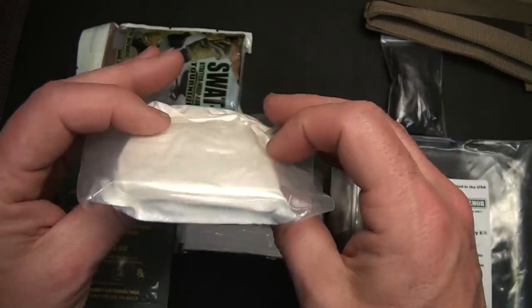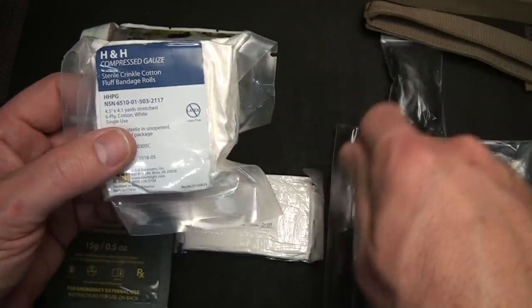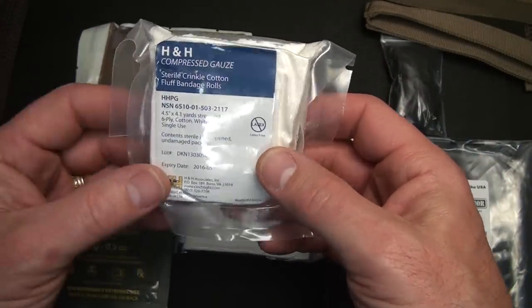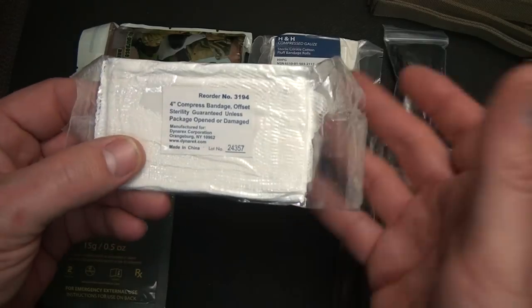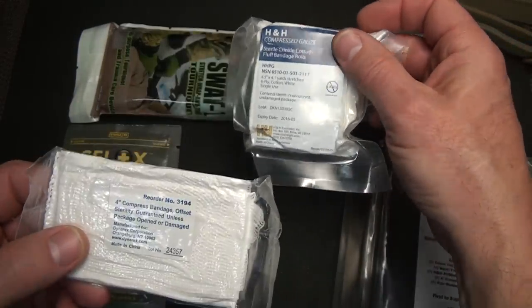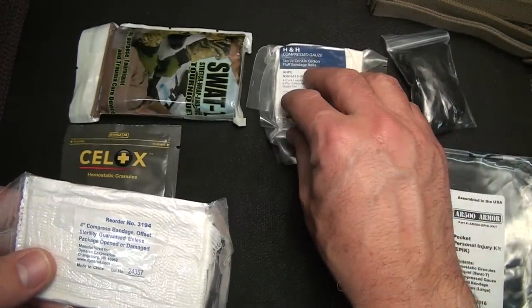And of course, this is a single use. You just use it, put it in. You can even wrap the excess around the leg, or arm if you need to, or whatever extremity that's wounded. And then we just have a 4-inch compression bandage. And this is something you're going to wrap the H&H compression gauze with if you're needing to use this entire amount.